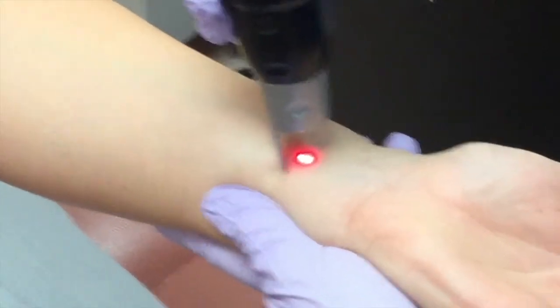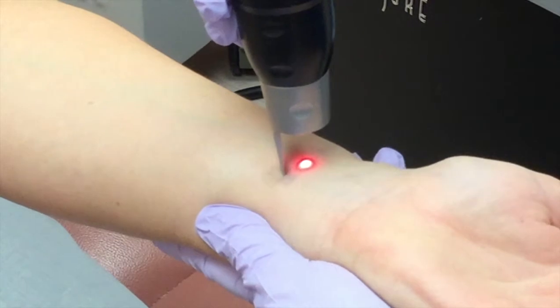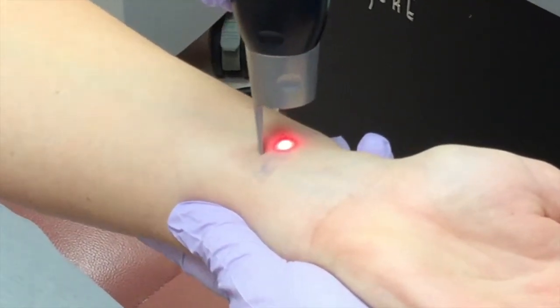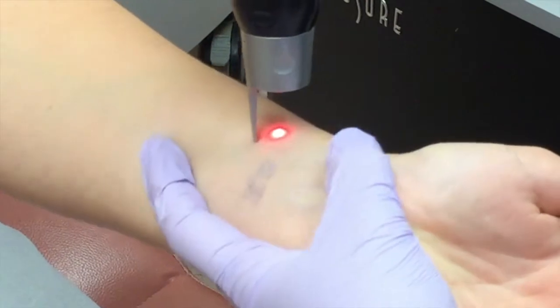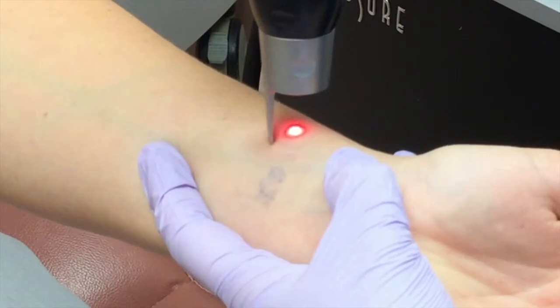And you can hear where it's louder — the beam, the laser wavelength, is seeking the pigment of the ink. So where there's less concentration of the ink, it is less loud, so it's softer.